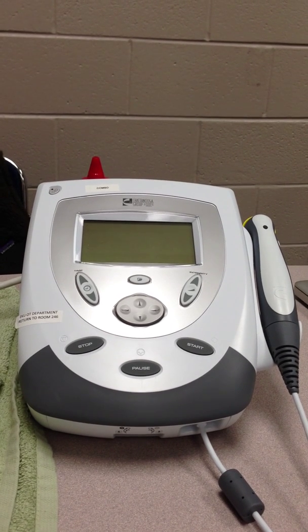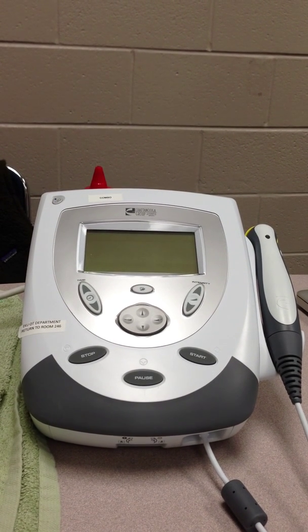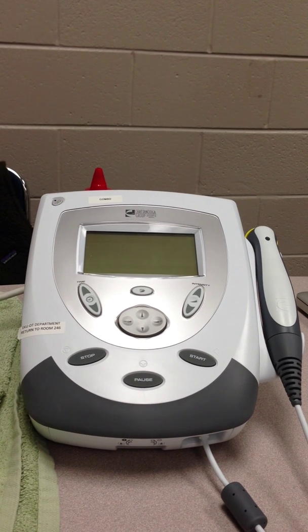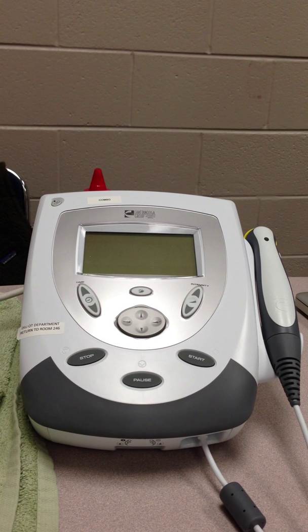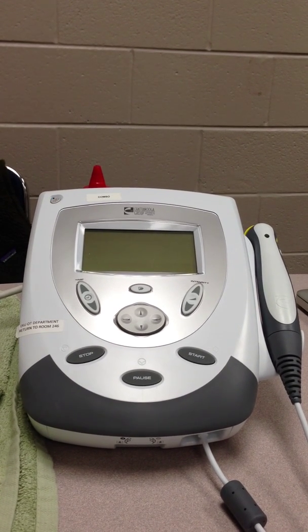Intensity. Studies are limited, however, 1 to 1.5 watts per centimeter squared should be sufficient to produce enough heat. Duration, 5 to 10 minutes. Frequency. Frequency should be established with the treating physician to maintain the drug level properly.